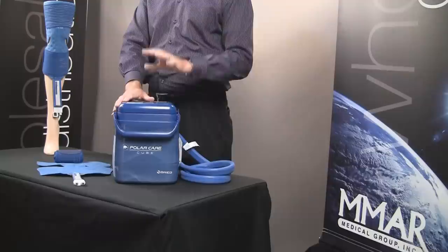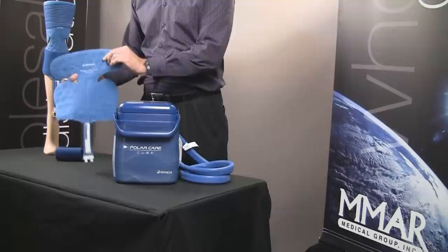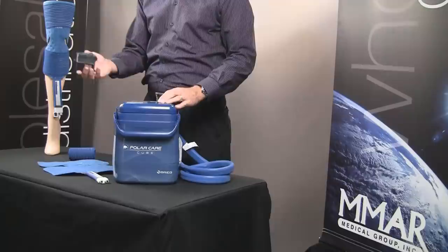We want to introduce the Cube. When you buy the Cube, you're going to get the bucket, you're going to get the pad — and there are many different pads for different parts of the body. This happens to be a knee pad, and as you can see demonstrated here, it fits onto the knee, wraps around with the ACE bandage that's also provided. You will also get a battery pack which plugs into the back of the unit.